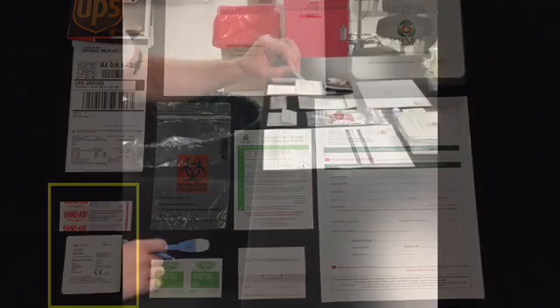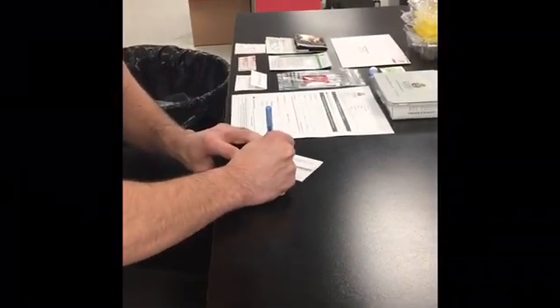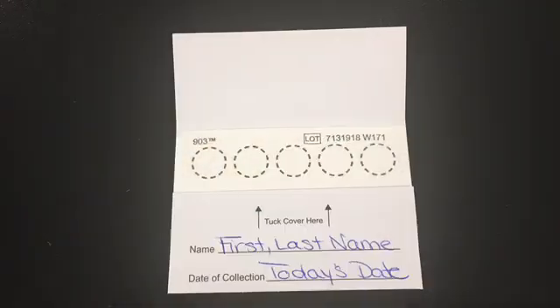Prior to sample collection, take the blood spot card and write the patient's first and last name clearly, as well as the collection date.